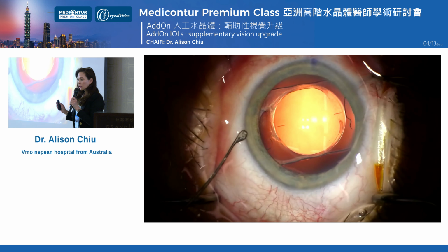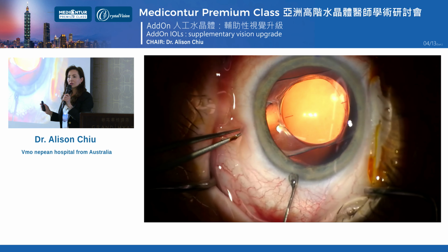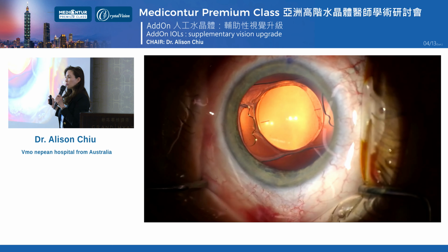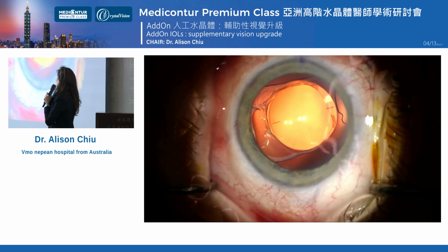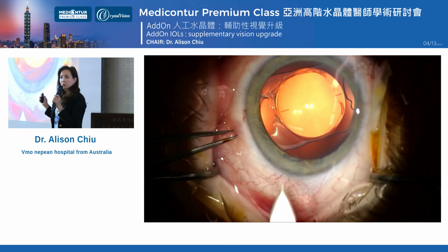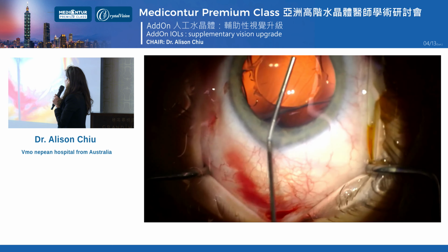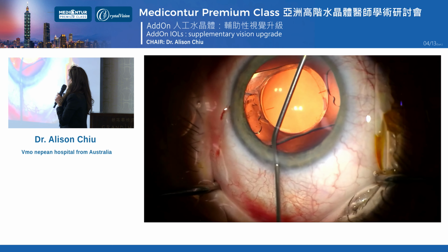So I just really want to start, I don't know how familiar you are with the lens, so I just really wanted to start with a video showing the implantation of the lens. So you can see there's a little bit of capsular fibrosis here. This is a secondary AddOn IOL implantation.